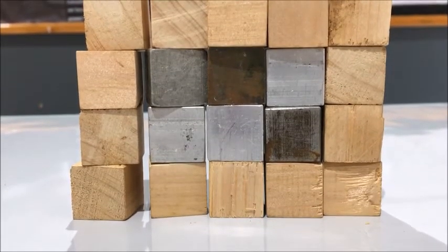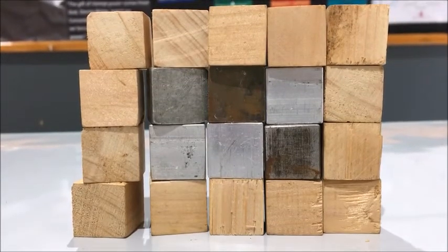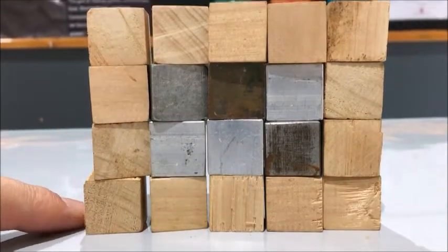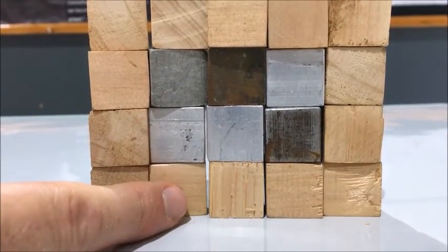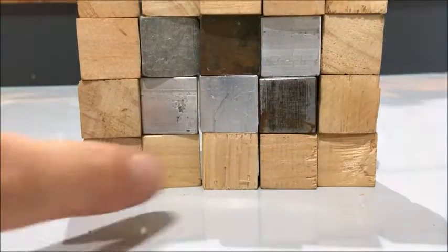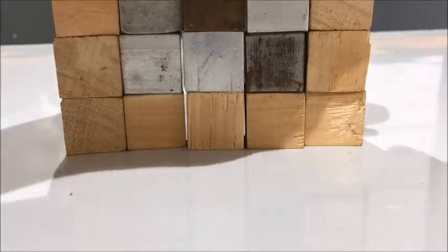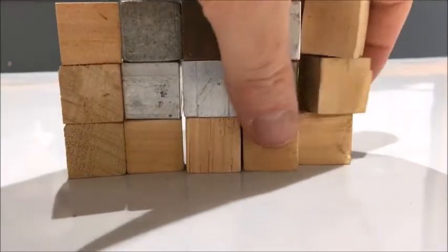And using those values, I can deduce what it is, but I have to do it by x-raying from several angles. So if I want to know what this voxel is made out of, I have to x-ray through that voxel, and when it comes through, it will actually go through those as well, won't it, to find out that value. So to deduce what it is, I'm just going to take some layers away now, so we can imagine just a bit more simply.